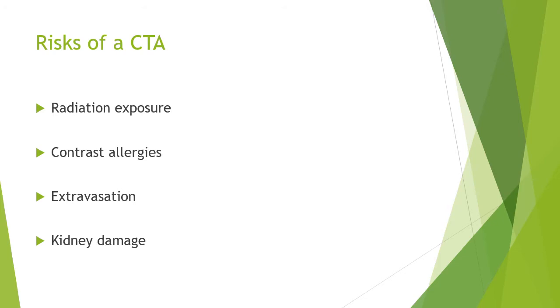There are multiple risks involved with a CTA runoff exam. There is, of course, the risk that comes with any radiation exposure and the potential effects associated with that. There's also a risk of an adverse contrast reaction, which is caused when a patient is allergic to contrast material. If this patient was allergic to contrast, we would pre-medicate the patient and closely monitor the patient throughout the exam.